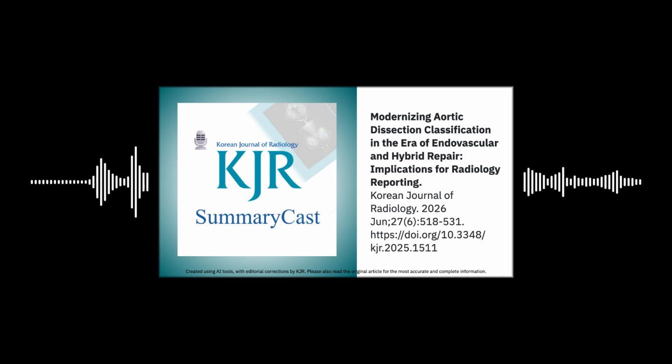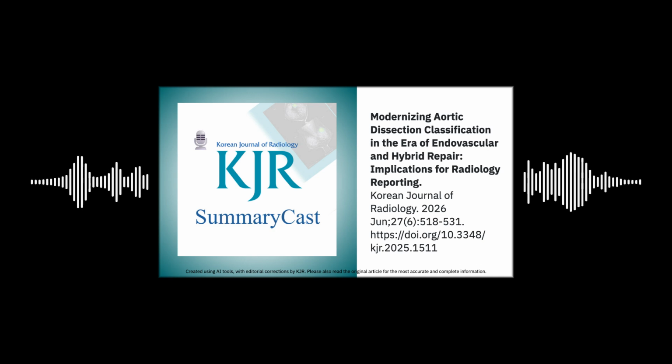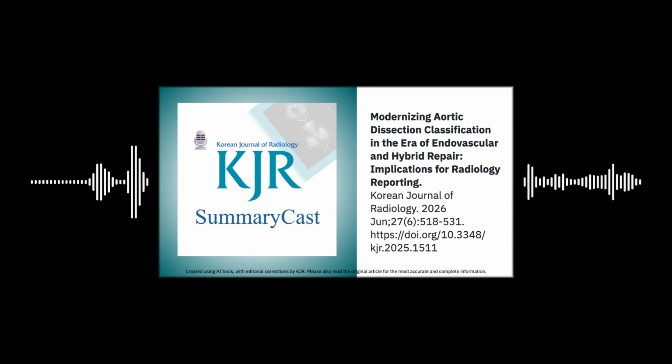This all leads to the main point of the paper. What should the radiologist actually put in the report? Right. The classifications are frameworks, but the report needs to be a practical, actionable document. The authors recommend a harmonized approach. Which means pick and choose? In a way, they suggest that for rapid communication, the type component from the TEM system, A, non-A, non-B, and B, is the most intuitive because it's based on the proximal extent, which aligns well with clinical urgency. So lead with the most dangerous anatomical involvement.